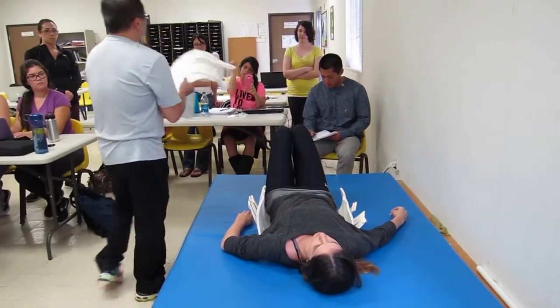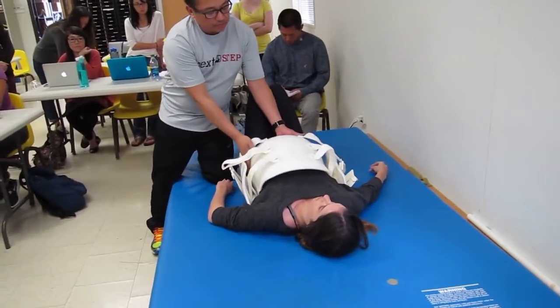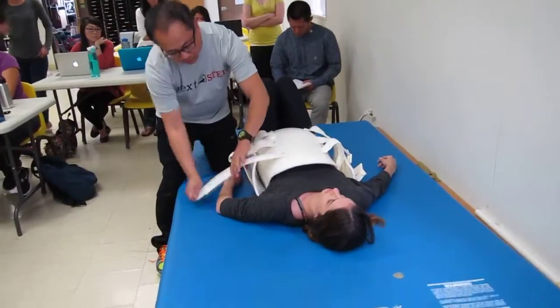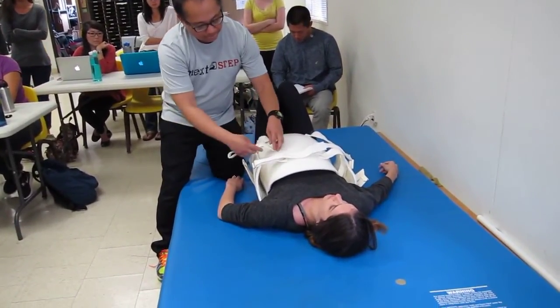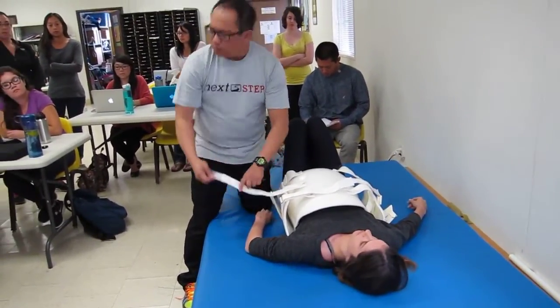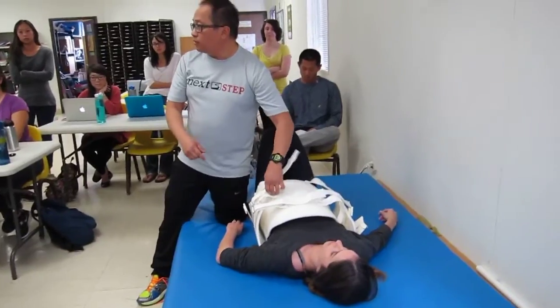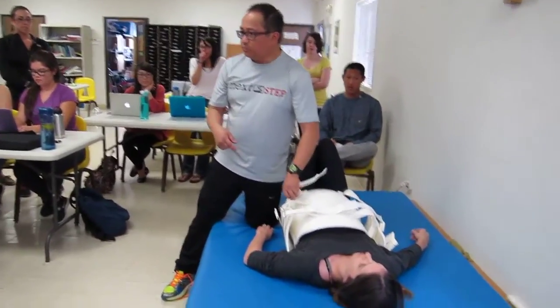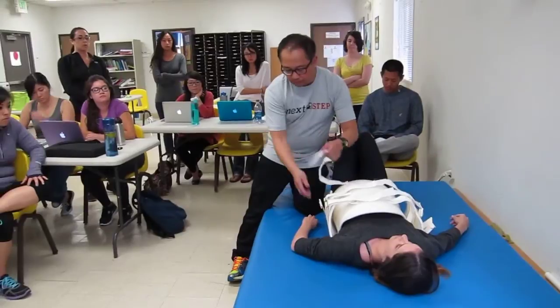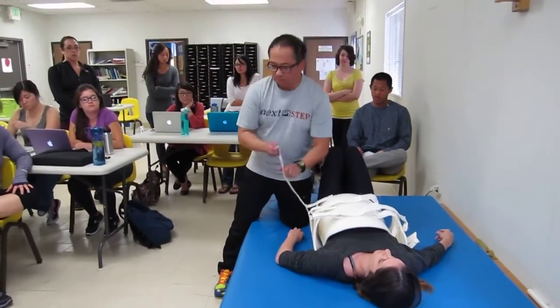Now I'm going to apply the front portion. This goes inside, just like so. Are they pretty contoured to each person? Yeah, not super tight, but all of these are custom made for each of the clients. The orthotics or prosthetics person will go into probably the OR or the ICU and measure the client. How do you know how tight to make it? You want it a little less than snug.